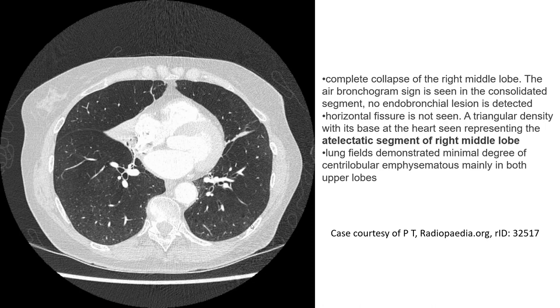The triangular density with its base at the heart represents the atelectatic segment of the right middle lobe. The lung field demonstrates a minimal degree of centrilobular emphysema mainly in both upper lobes.